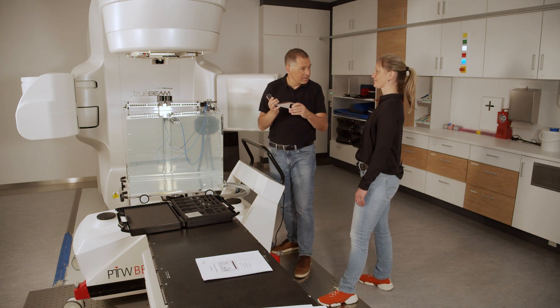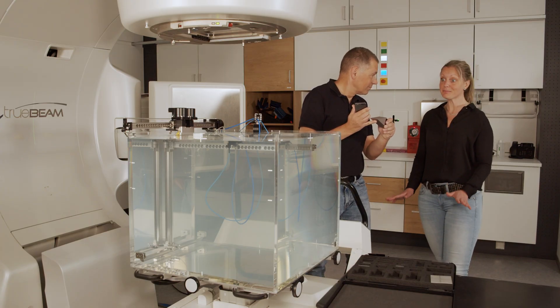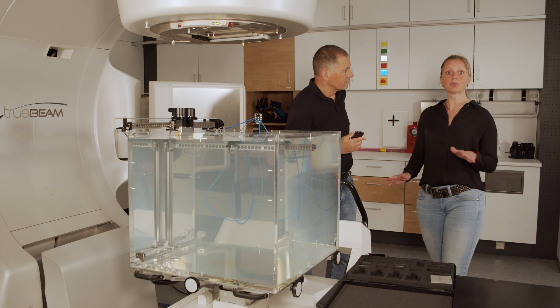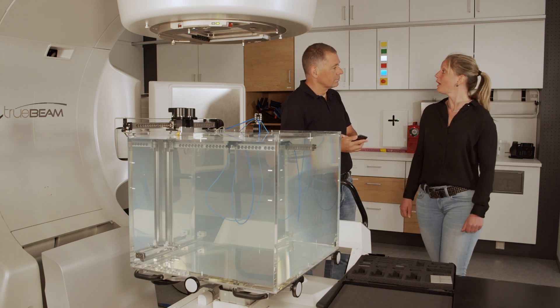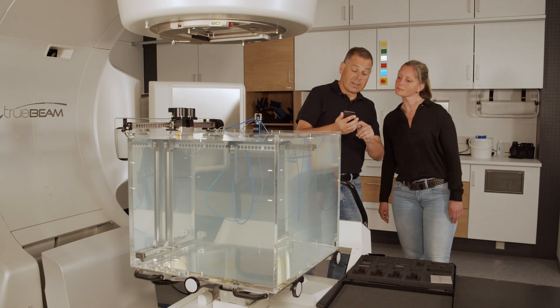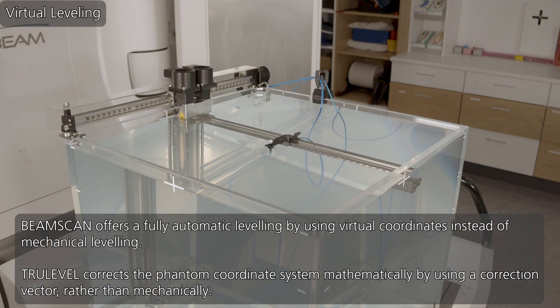Should I get some wedges to get the phantom into the water? No, really. BeamScan can do it. It can measure the water surface and realizes the leveling through virtual coordinates. You don't need mechanical leveling when you can use math. Okay, so let's try it. It's leveling. Start.